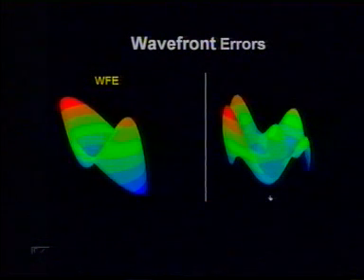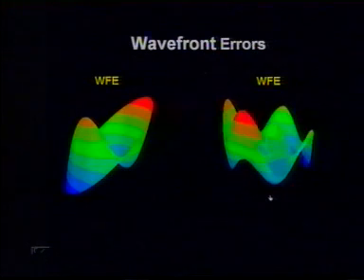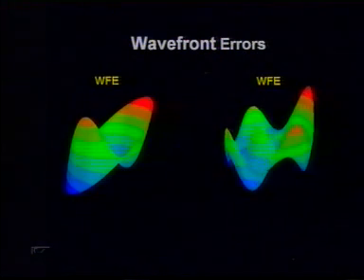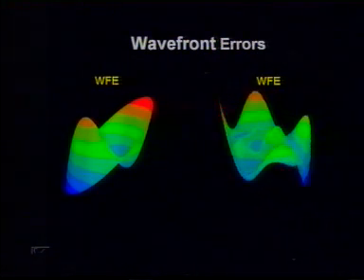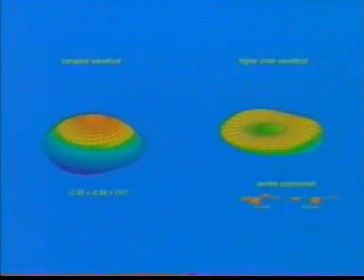Previous methods of measuring the eye's wave aberration can measure only the static properties of the wave aberration. The Wasker wavefront analyzer effectively monitors the dynamic accommodation process. This highly reproducible measurement provides an objective characterization of changes of the pseudophakic eye's aberrations beyond defocus. It allows us to investigate the functionality of accommodative IOLs irrespective of their underlying functional thesis.